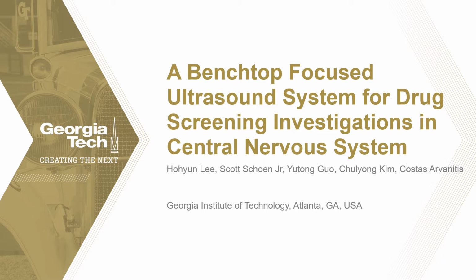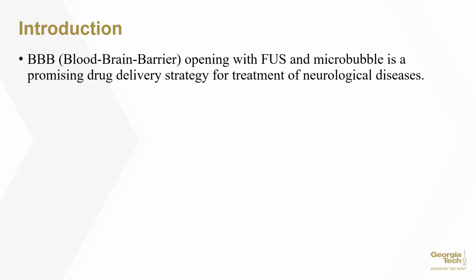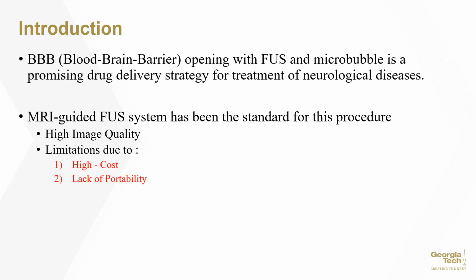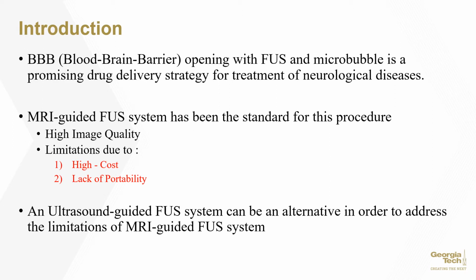In central nervous system, BBB opening with focused ultrasound and microbubble is a promising drug delivery strategy for treatment of neurological diseases. An MRI-guided FUS system has been the standard for this procedure due to its high image quality, but it's limited due to its high cost and lack of portability. So an ultrasound-guided FUS system can be an alternative in order to address the limitations of the current MRI-guided FUS system.